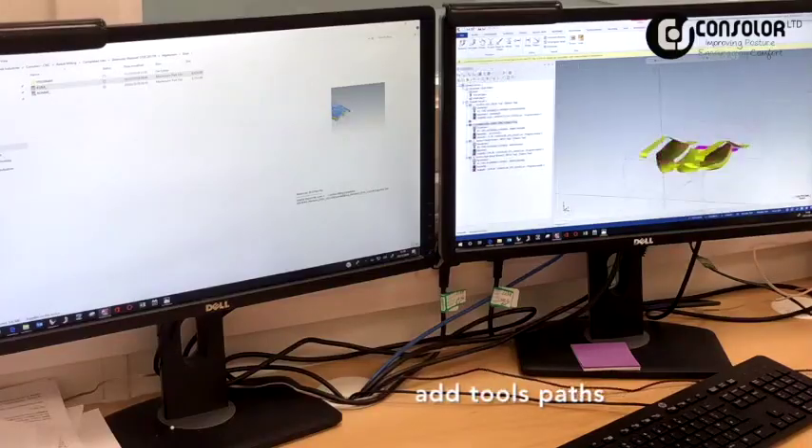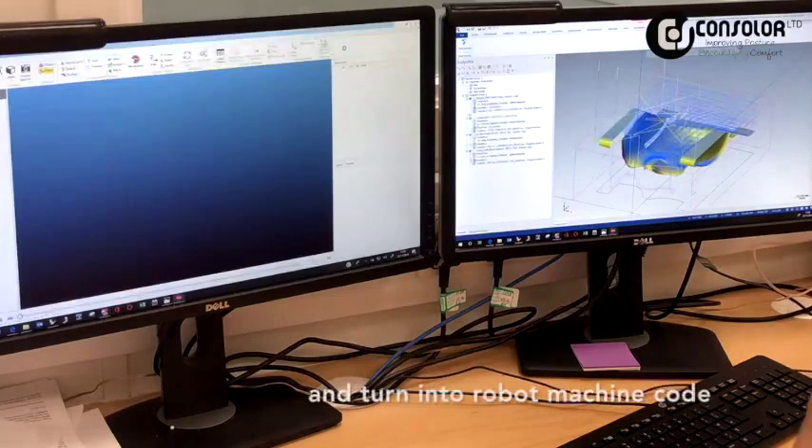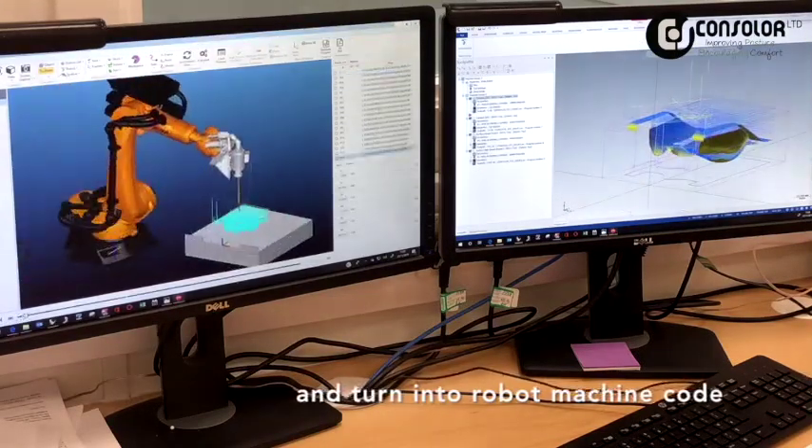The seat shape then needs to be sent to the robot, so the drawings are turned into robot code and a complete robot test run is modelled digitally.